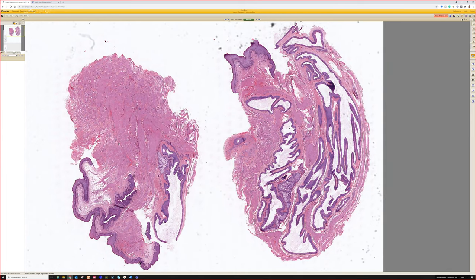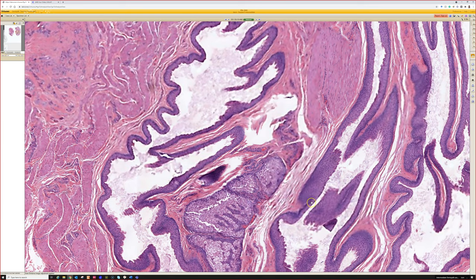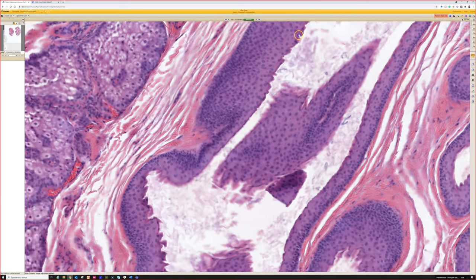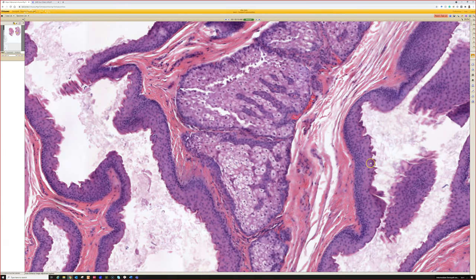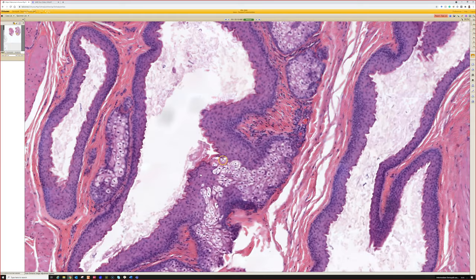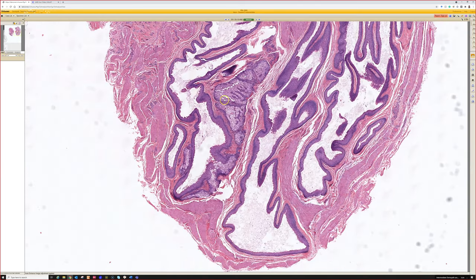And this is another classic, perfect one. What's this? So yes, this is a perfect steatocystoma. We've got cystic spaces with stratified squamous lining, but then we've got that jagged, bright pink or red refractile cuticle and the sawtooth shape of the lining. And that alone is enough to make the diagnosis, but when you're really lucky, you'll actually see sebaceous glands coming right in and draining into the cyst. So this is recapitulating the sebaceous duct part of the hair follicle, which has that same bright pink lining. So really nice. This is a true sebaceous cyst, if you like, but steatocystoma.